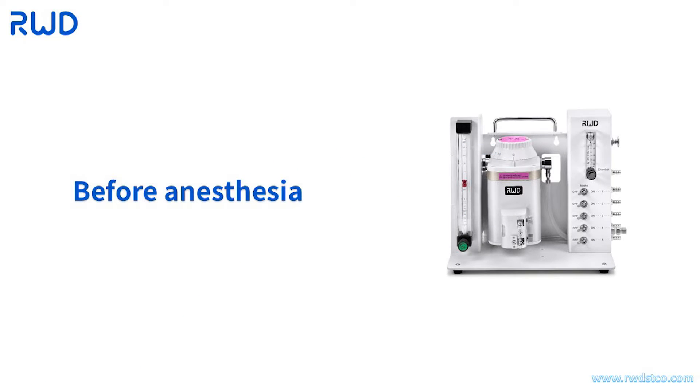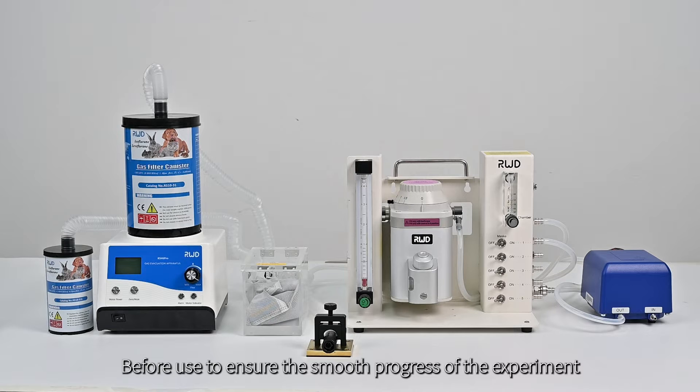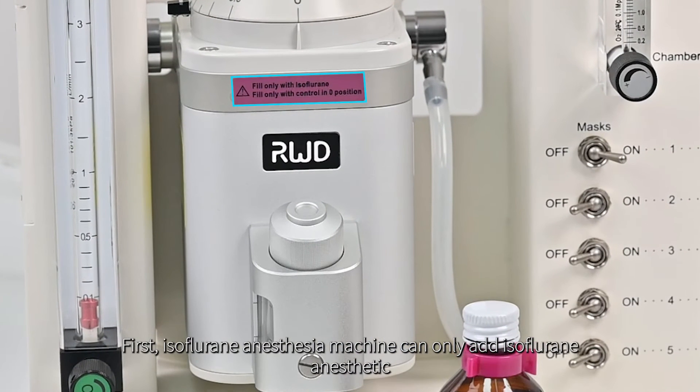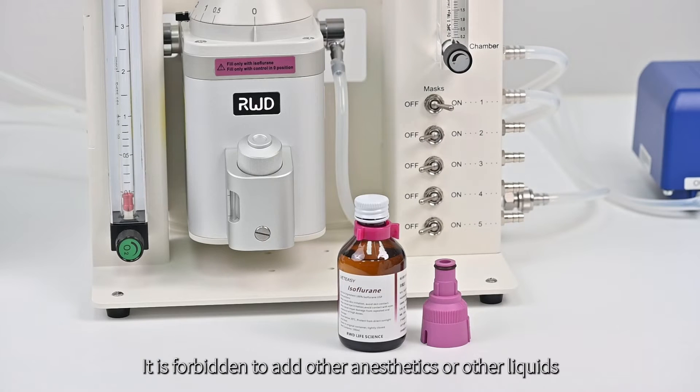Before anesthesia, we recommend that you perform the following self-checks on the instrument to ensure the smooth progress of the experiment. First, isoflurane anesthesia machine can only add isoflurane anesthetic. It is forbidden to add other anesthetics or other liquids.